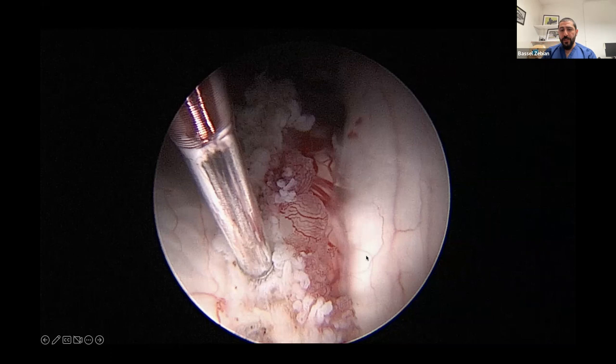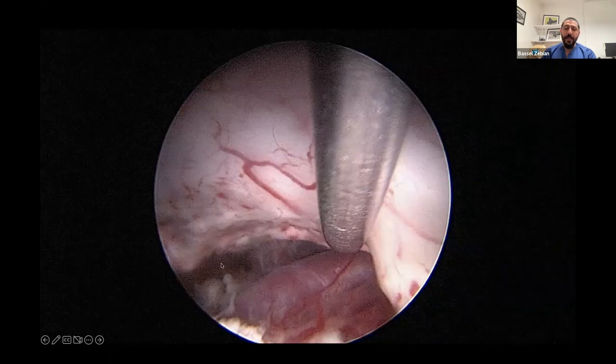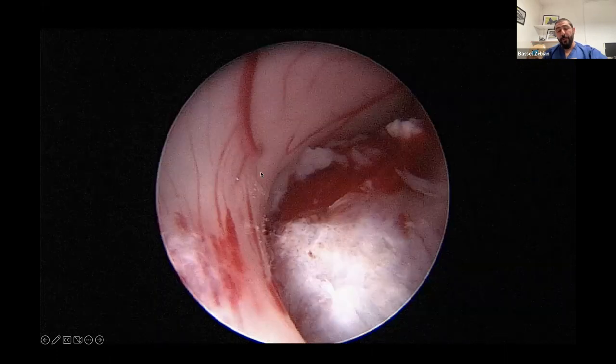So that's the fornix here, medially, tenia fornicis, and the choroid plexus that we've coagulated and pushed down. And then now we're looking towards the fornix and the internal cerebral vein. We're lifting the fornix up, and that's going in, looking back. The massa intermedia you can divide when it's very thin. Obviously, I wouldn't say with kissing thalami you should be doing that. With kissing thalami, that means the third ventricle is really small, so you probably shouldn't go in with an endoscope to try and do this for a biopsy, perhaps. And this is a typical teratomatous type of tumor.